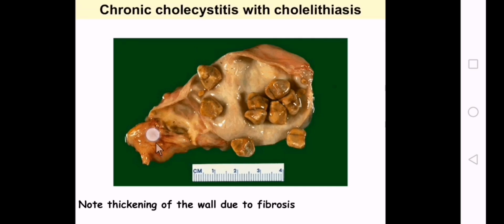In this slide we see an excised gall bladder. لما نفتحوها لقوها filled with gallbladder stones. It's called cholelithiasis. Lithiasis mean stones. If you know that the wall of the gallbladder is thickened, هاي الثickening من جاية thickened نتيجة الفايبروسيس of chronic irritation. هاي الستونز سوت injury للwall of the gallbladder, فصار chronic inflammation و sometimes it's accompanied by acute cholecystitis. المهم there is a thickening of the wall due to fibrosis of chronic inflammation. So the diagnosis here is chronic cholecystitis with cholelithiasis.